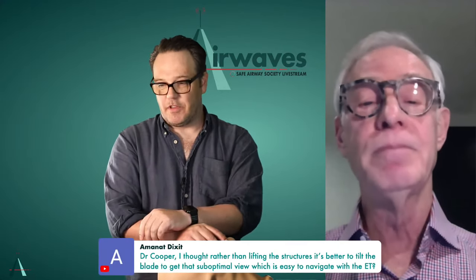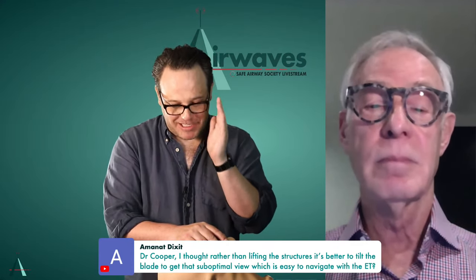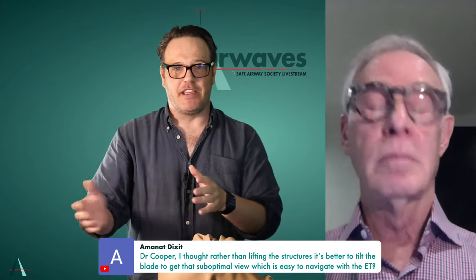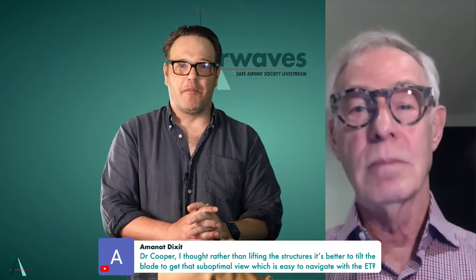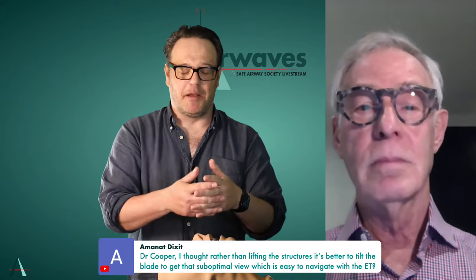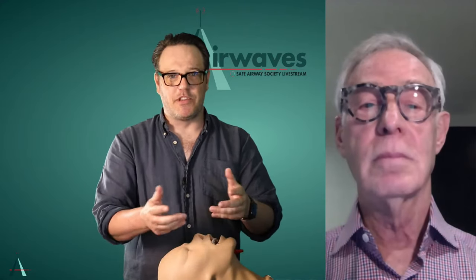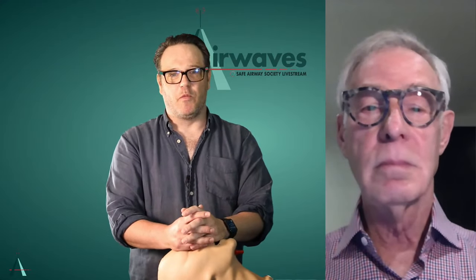Thanks for that question. You've just reminded me of something, Richard, that I was wrestling with yesterday, and I've been percolating on your answer. We were talking about the size blade you would use, where the C-Mac is just one size, but the GlideScope adult blades come in a 3 and a 4. You were saying that you recommend, and I know Louise Ellard, who was your fellow a few years back, who did a live stream recently, also has recommended the 3. Do you want to just run through why you would default to a 3 blade?